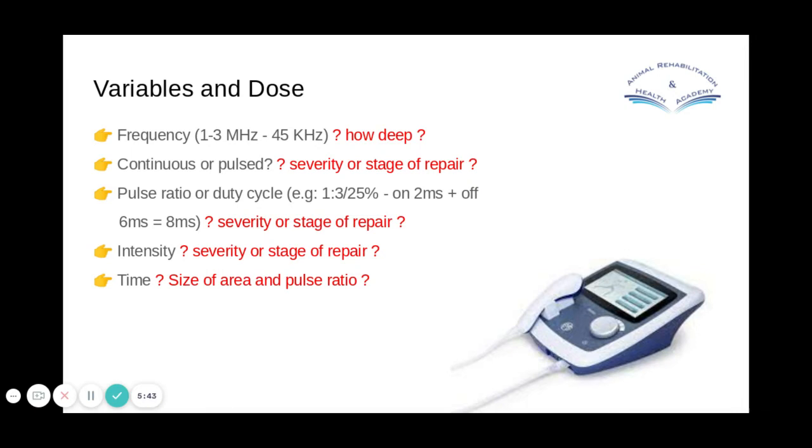There's a lot more to this actually that is covered in our course on therapeutic ultrasound, but let's just keep it simple here. About 4 up to 5 centimeters, possibly 6. But if you select 1 megahertz, that's the sort of depth that you're looking at. And then if you want to be more superficial than that, up to about 2 centimeters, you're going to want to select 3 megahertz.